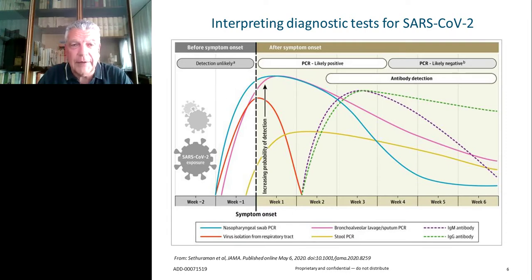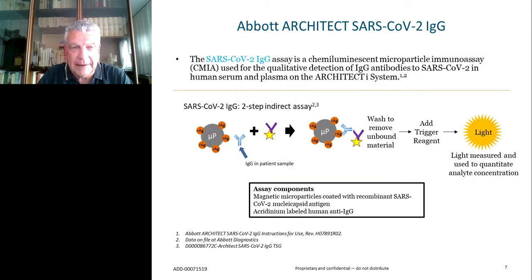And this, as we have noticed, is even recommended. Now, how may you do that? One possible solution is to use this kind of assay. This comes from Abbott Diagnostics. It's an assay for specific IgG to SARS-CoV-2, and it's targeting a recombinant antigen from the nucleocapsid region of the virus. So there are several topics to deal with.